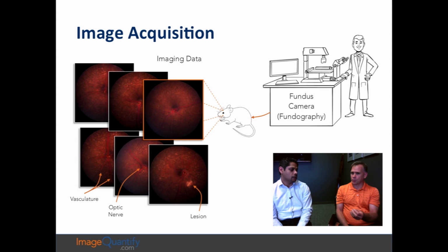When you talk about shadowing, is it lit? Is there a light? Yeah, the light goes into the eye. And there's a camera on the back end, so it's acquiring an image. Got it. And when you talk about averaging multiple images, it's not really video. You're kind of snapshotting.